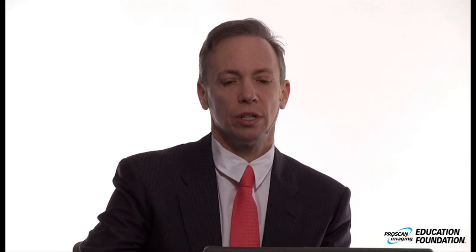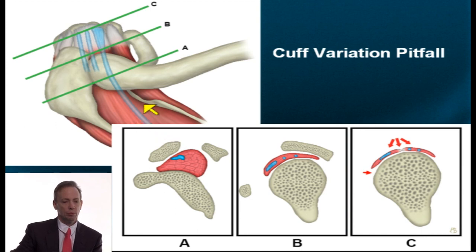We finished discussing how a cystic tear might migrate through a small rent or separation of the rotator interval, then dissect along a tendon and be seen as a little round structure. At the end of that round structure it may flare out and create what's known as a sentinel cyst — it looks a little bit like the end of a trumpet. There is the end of our trumpet traveling along with the supraspinatus tendon on a sagittal view, highlighted as an oval hyper-intense structure. You can track this bright signal intensity structure on a series of sagittal images.